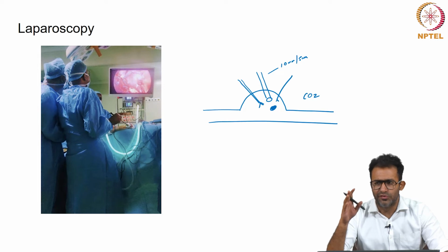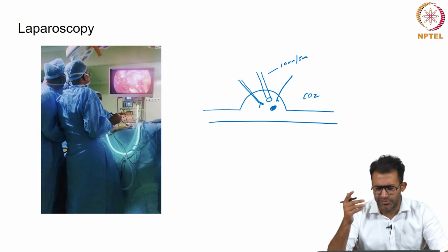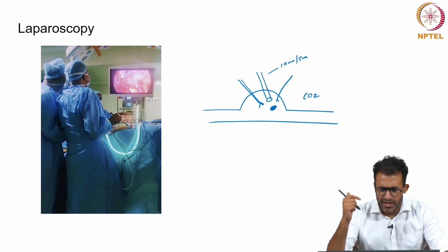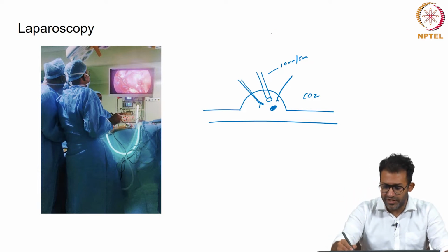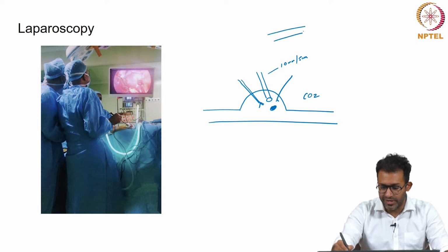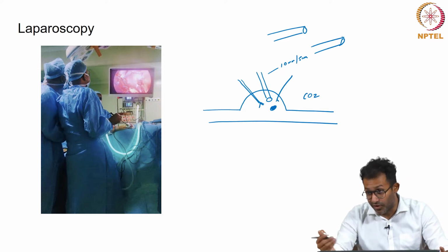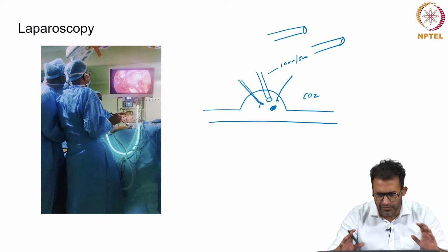There are a whole host of videos available on YouTube or any other platform, so you can watch them to understand what really happens in laparoscopy. There's a lot of physics and optics involved in laparoscopy. We have different types of cameras. There are 0-degree cameras, then we have 30-degree cameras, which allow for a greater degree of movement. There are 45-degree cameras. Each of them has their own different applications.